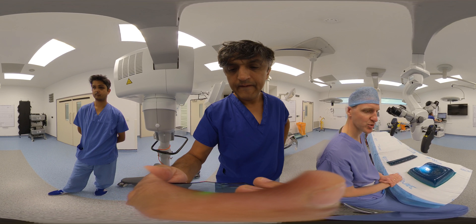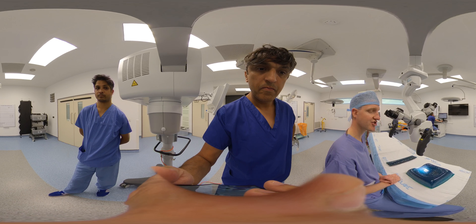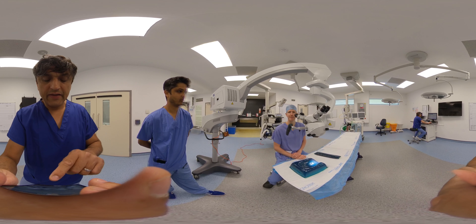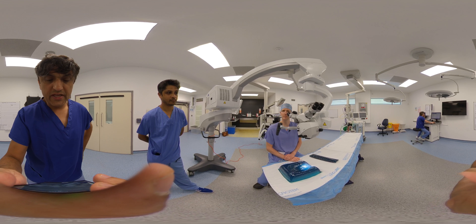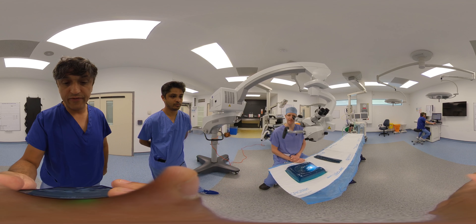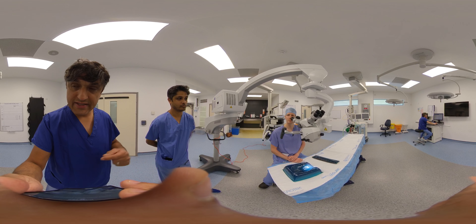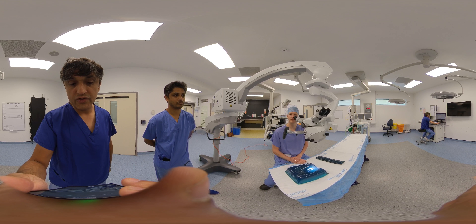You have to make that balance between having the resolution and magnification you need, but also the versatility that comes from being slightly more zoomed out. The more zoomed in you are, the quicker it is to be out of that depth of focus. So you tend to balance the benefit of higher magnification versus the disadvantage of a very shallow depth of field.